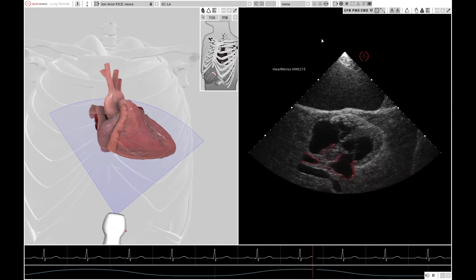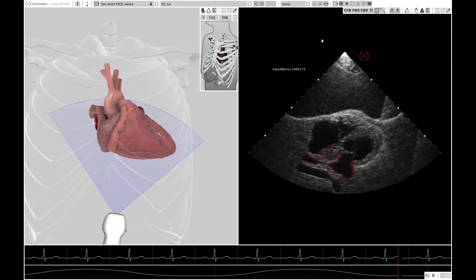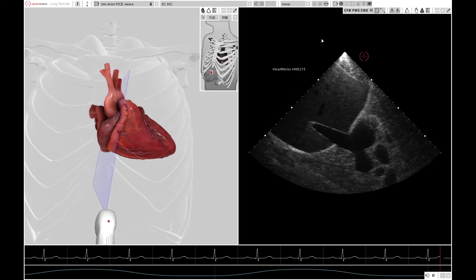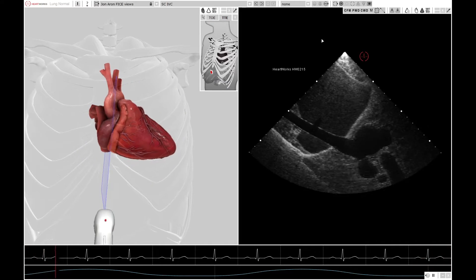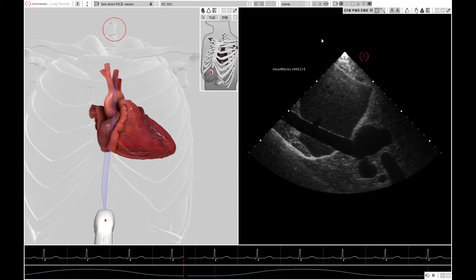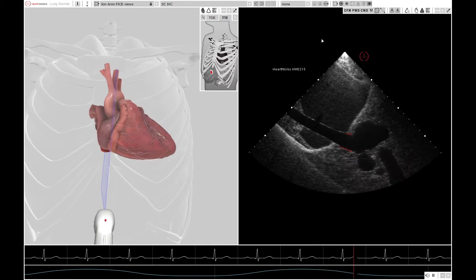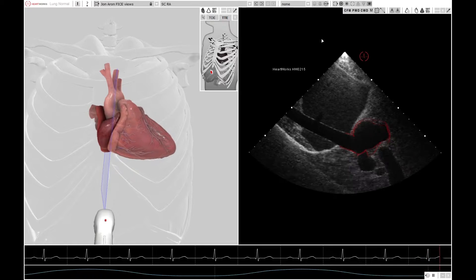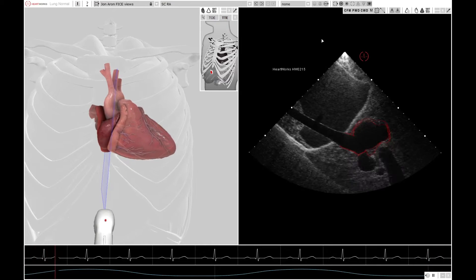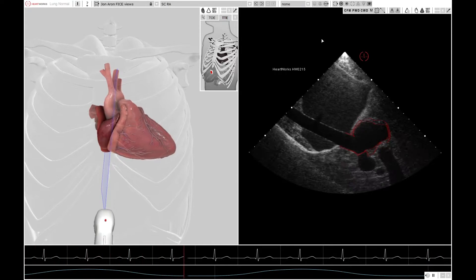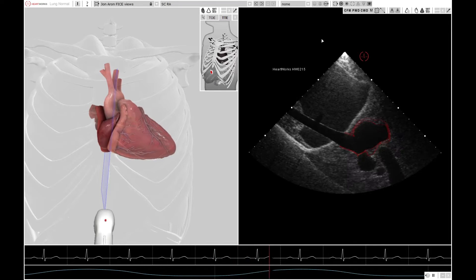The final view is achieved by rotating the probe 90 degrees so the pointer is now pointing towards the head. This allows you to image the IVC, which you can see entering the right atrium as demonstrated on the image. This may be useful in assessing the volume state of your critically unwell patient.